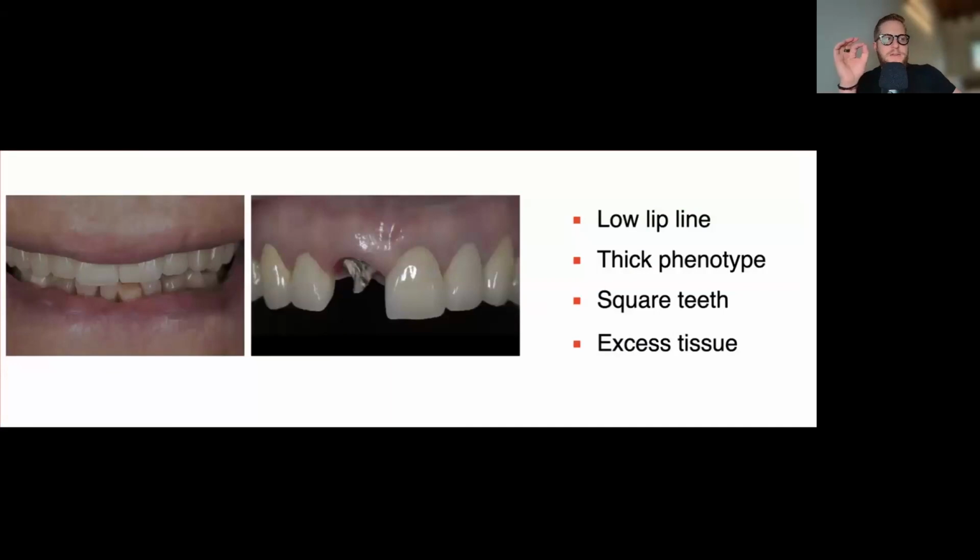And I say try to place the implant because we always tell our patients that we're going to try and do an immediate implant placement, and we're going to try and do an immediate provisional. And there are some cases that we decide not to do it during the surgery because the anatomy changed, because we didn't have enough initial stability, for example, or many other factors that we have to decide on the fly.